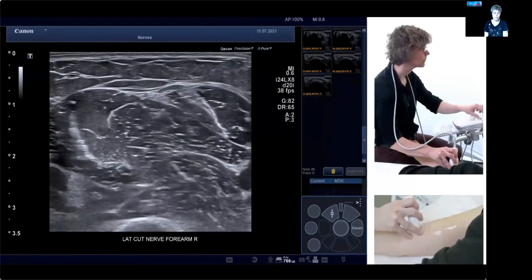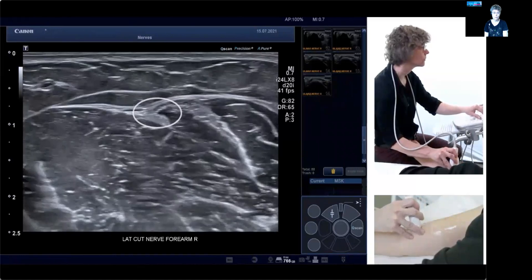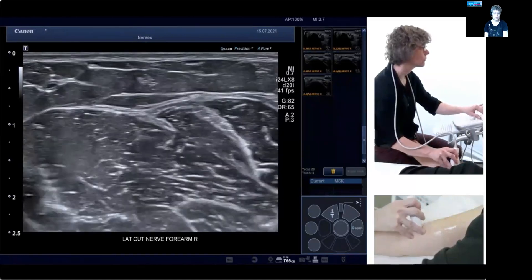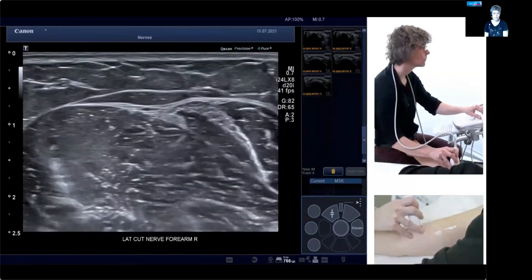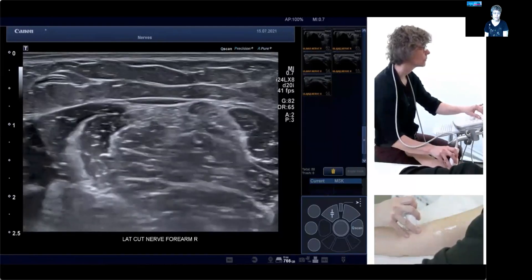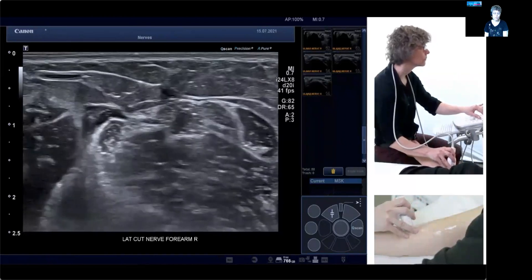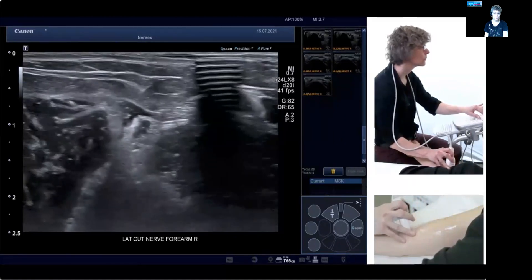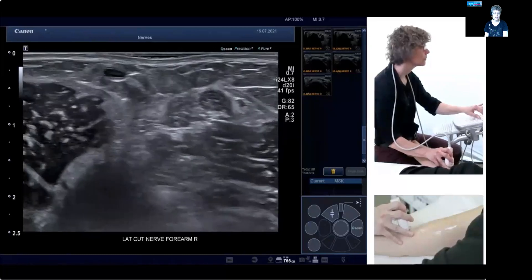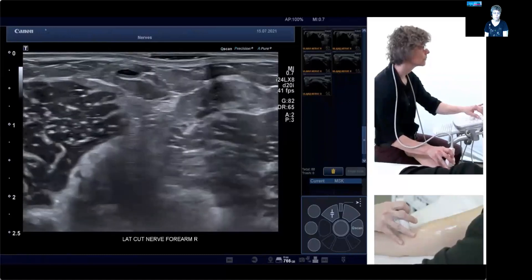Now the nerve surfaces, and we need to adjust the depth setting to get a nice view of it — it's in that circle there. Going back and forth a little bit here, you can see it trying to surface through the fascia. It will end up where every sensory nerve can be found, just in the deeper layers of the subcutaneous tissue. There's a little loss of gel contact here with the stripe artifact, but there's the nerve again, right in the middle of the screen.